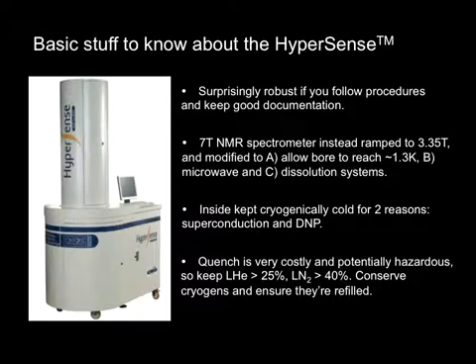And the helium is particularly an issue because these days, you guys may know, there's this global shortage of helium. So it's quite expensive at the moment, and probably is likely to remain so for a while. I'm not sure exactly what we're paying for helium, but I estimated it was a few $1,000s worth of helium in here at a time. And the nitrogen is probably only $100 or $200 worth.